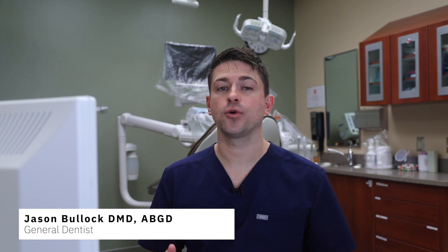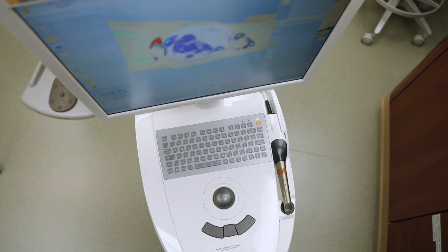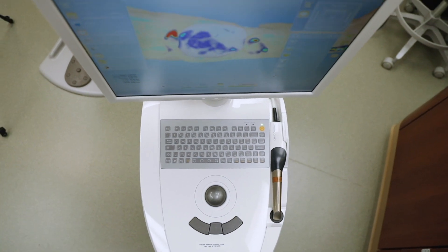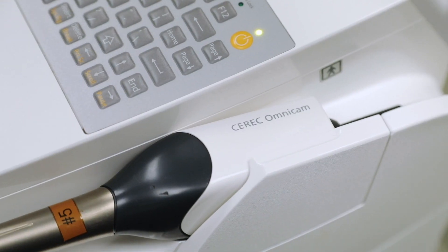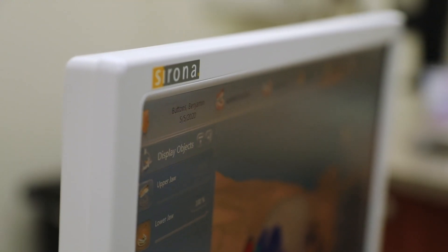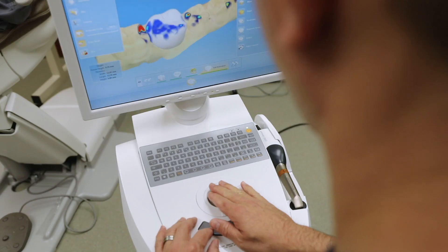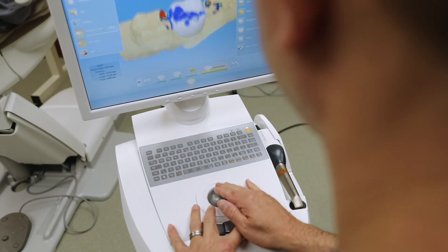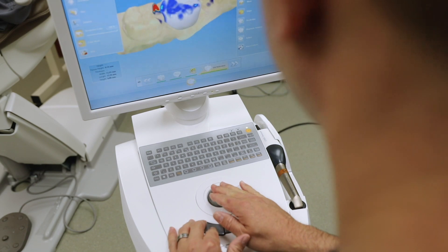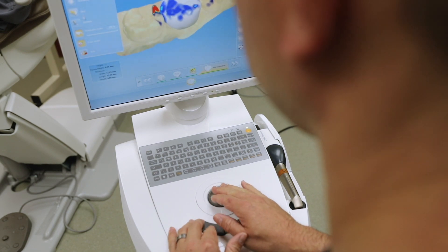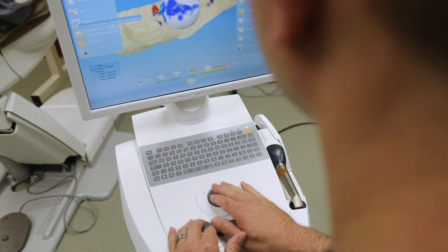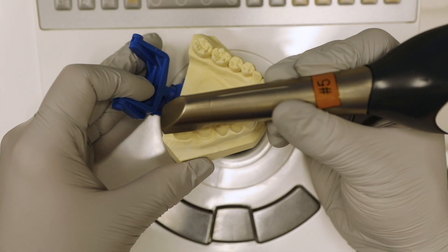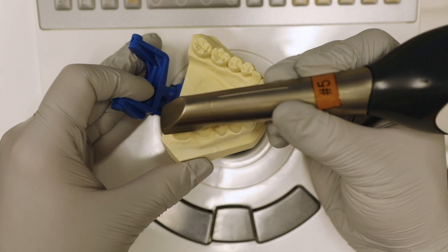I'm going to go through the software and show you the different screens and menus you will see when scanning and designing a restoration.